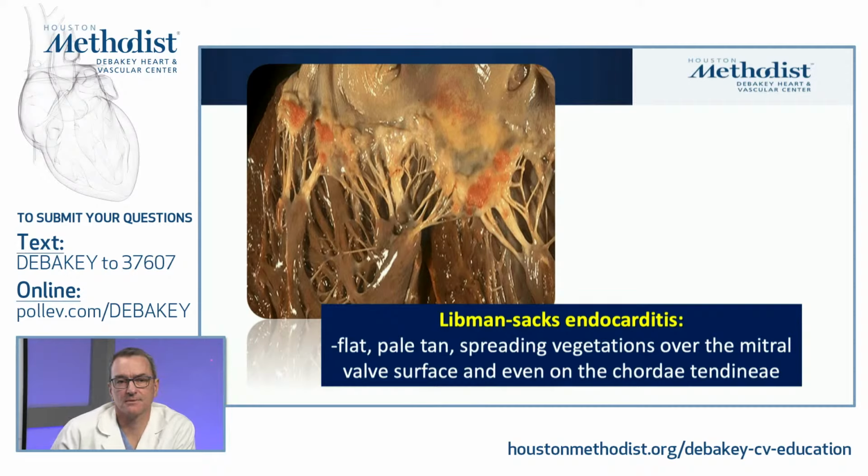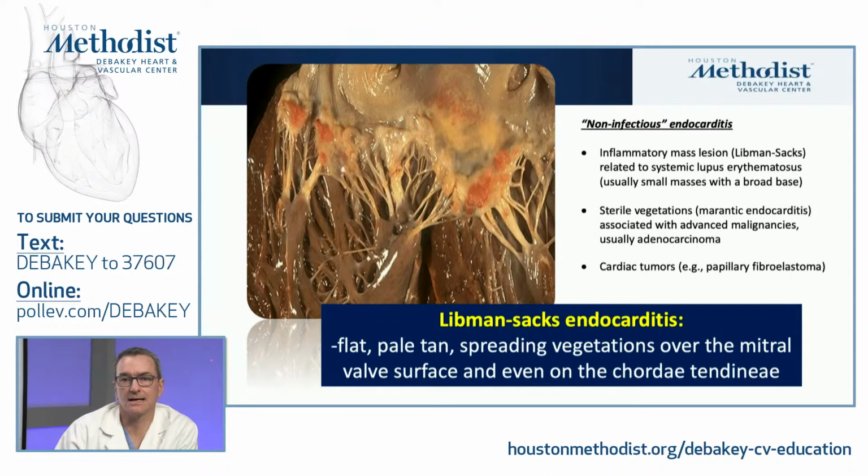This is a pathologic specimen. These are flat, pale tan lesions all along the closure surface. So not a discrete singular location, but really quite diffuse, even on the chordae at times. So this is a whole class of non-infectious endocarditis. The inflammatory mass lesion like this one, Libman-Sacks, is generally associated with SLE. Sterile vegetations are also referred to as marantic endocarditis, usually associated with advanced malignancies, particularly adenocarcinoma. And then finally, some cardiac tumors, particularly papillary fibroelastoma, can be quite difficult to differentiate from endocarditis.